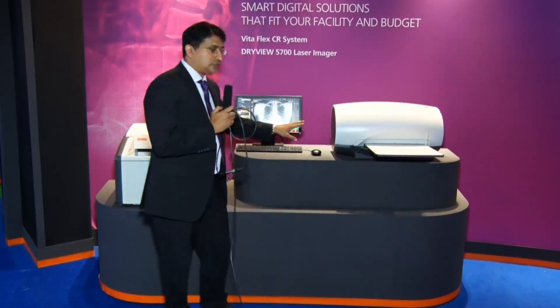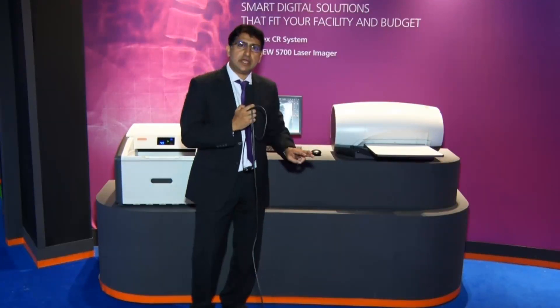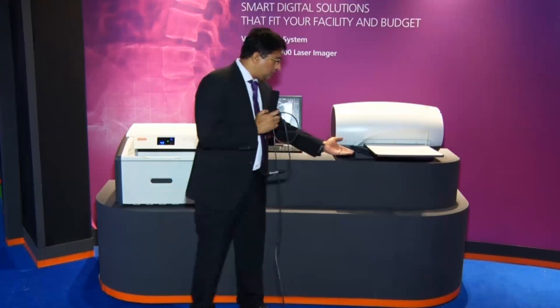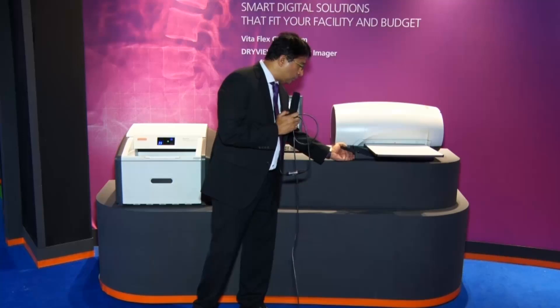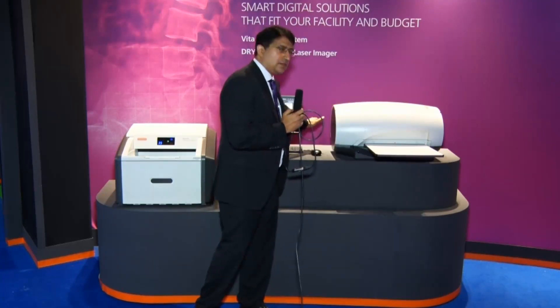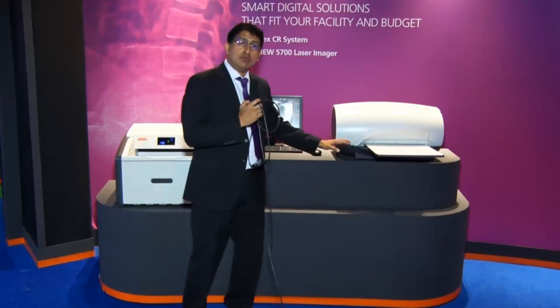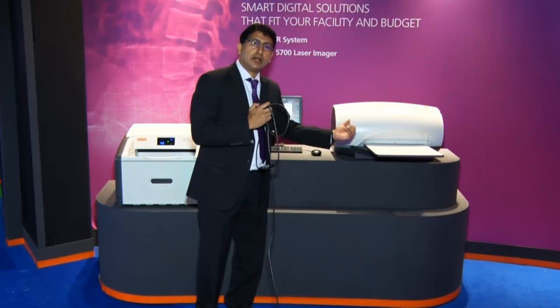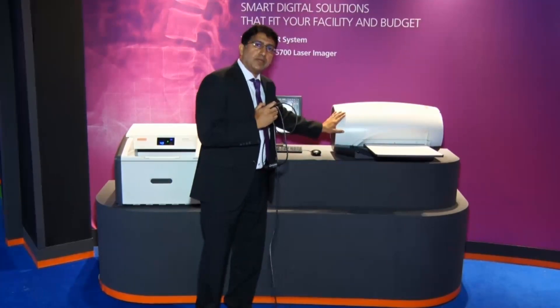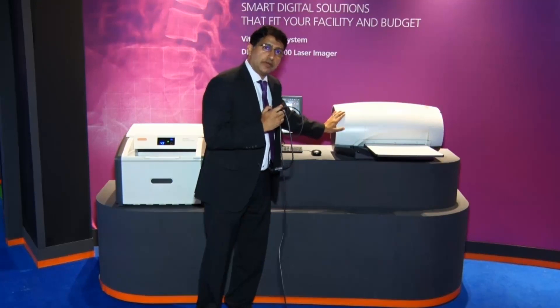This is the first FRU — Field Replaceable Unit — which means the system comes in three parts: the scanning module, the cover, and the power unit. So if anything goes wrong, the customer can courier a part, and Carestream is able to send the replacement back, with no need for an on-site field engineer to come and rectify the system.